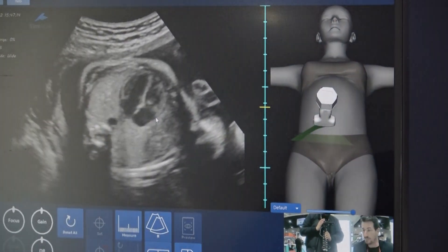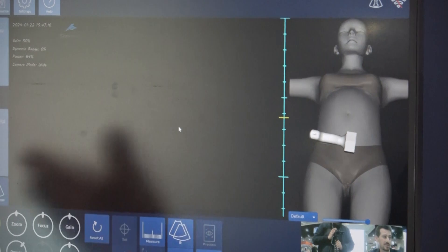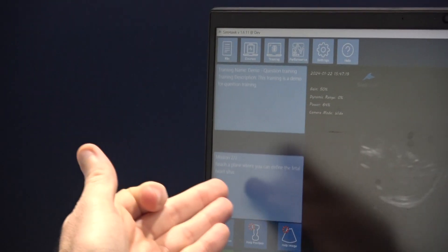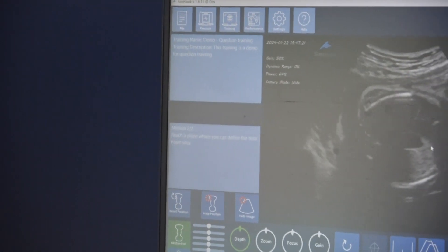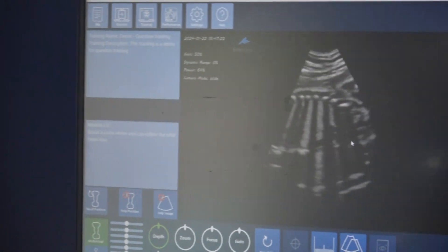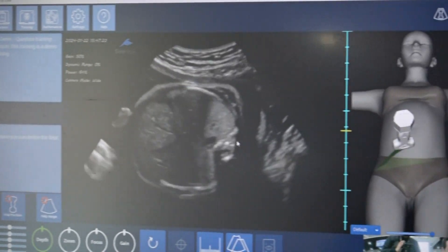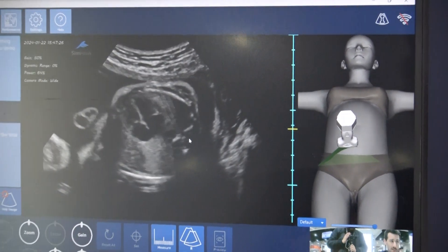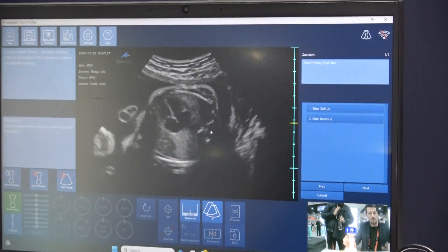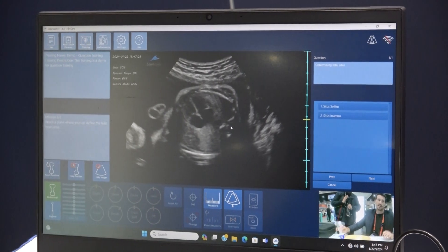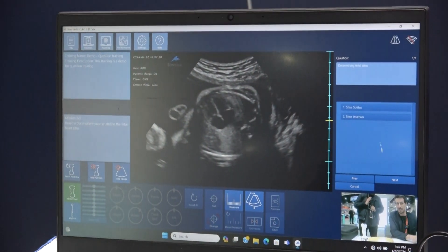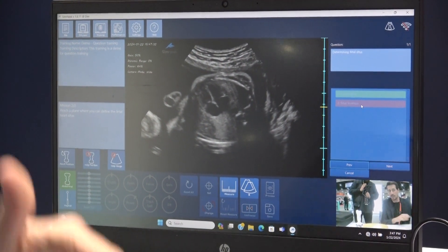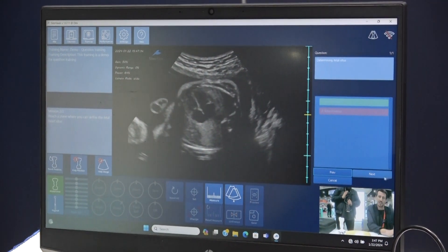The second mission now is to reach a plane where you can define a fetal heart series. I know I need to go 180 degrees, and this is a good view that I would like to get. I will save it. Another question: determine the fetal situs. If I give the wrong answer, it will tell me I'm wrong and give me the right answer.